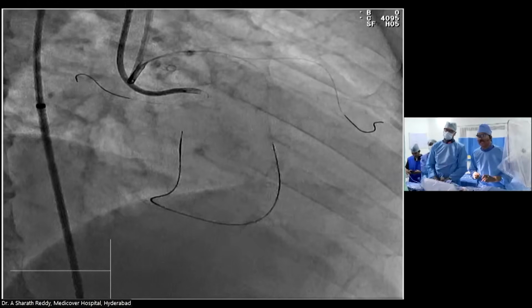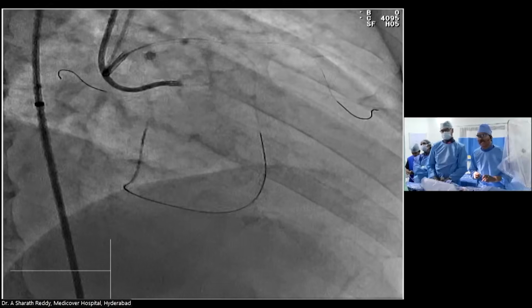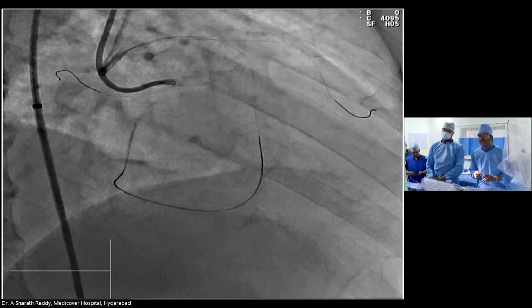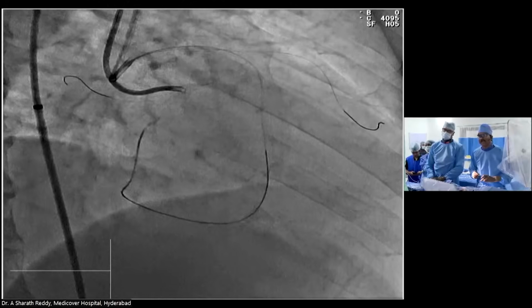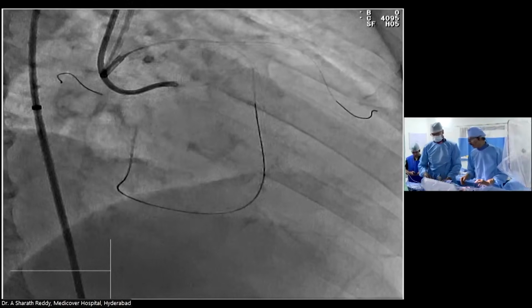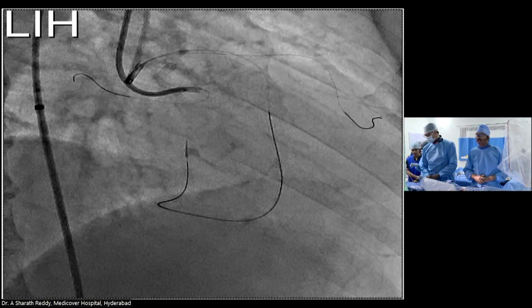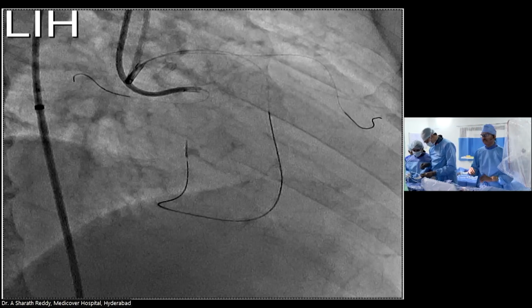Yeah, so I'll just escalate to Gaia 3 as you suggested. If it doesn't work, then I'll move on to Hornet. What I would even suggest is, give me Gaia 3, leave the wire there and the collateral there, and now try with a stiff wire to puncture antegrade, because if you don't mark the antegrade cap, your retrograde wire could go into no man's land.